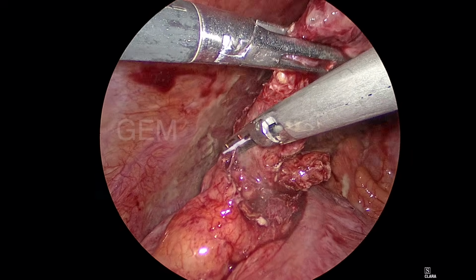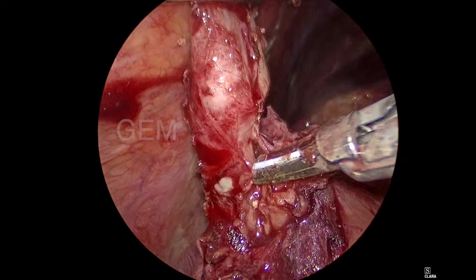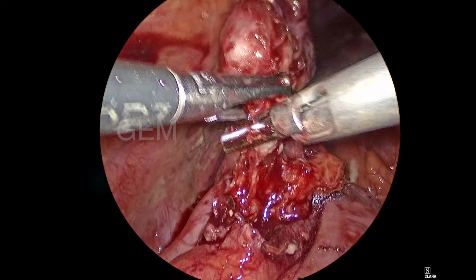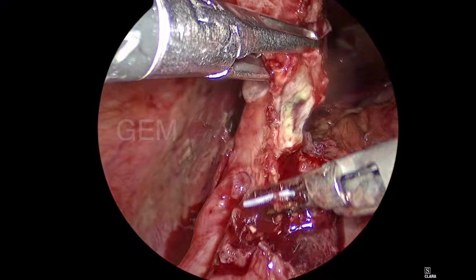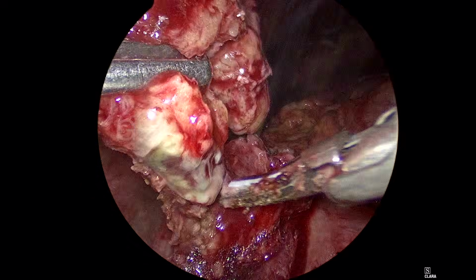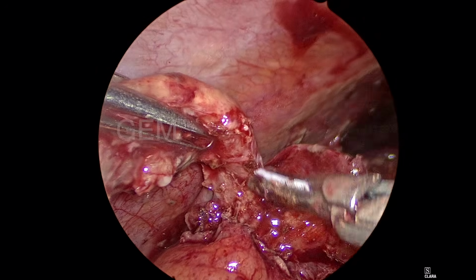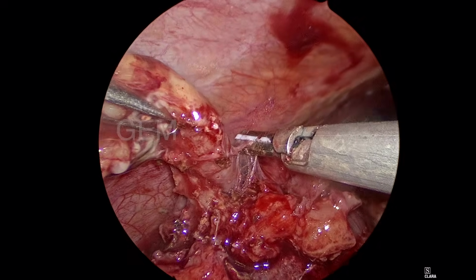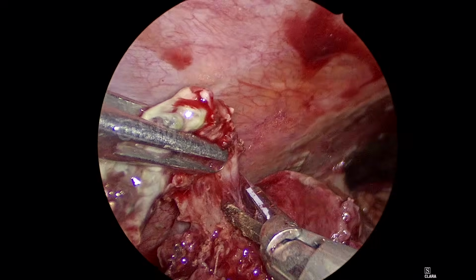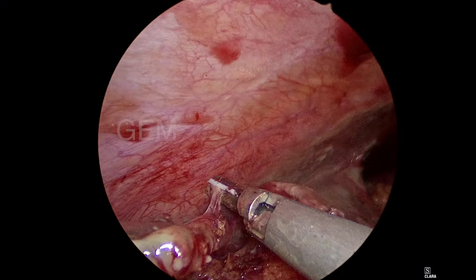So again I am using the harmonic scalpel. Without any bleeding, and without much lateral thermal spread with the harmonic scalpel, the cecal wall and other structures are protected. Thermal injury will be prevented compared with monopolar and bipolar, so it is safer than any other energy device. I am taking out the cecal wall and the peritoneal covering. So almost to the curved area I came. That side is cecum, this side is meso appendix.